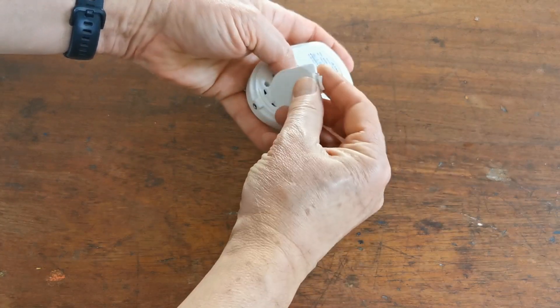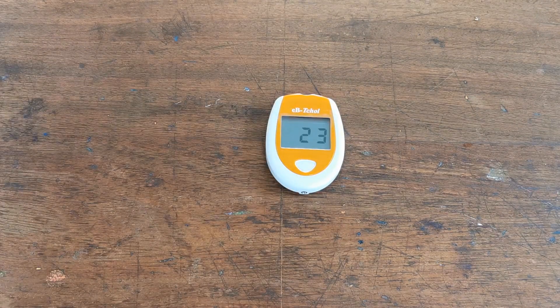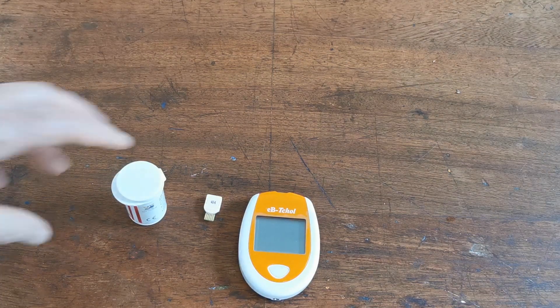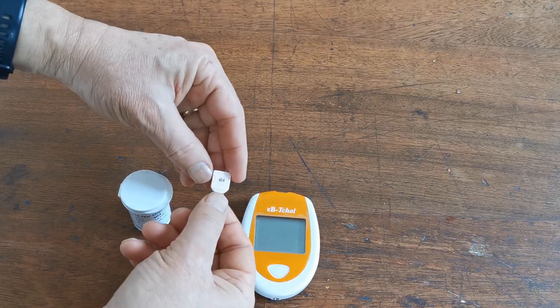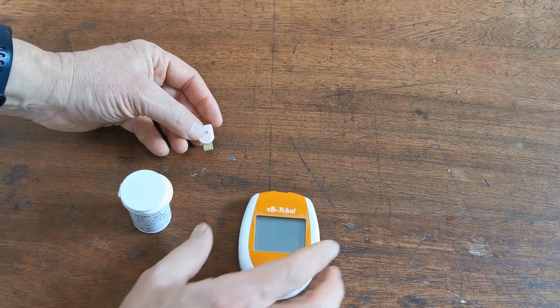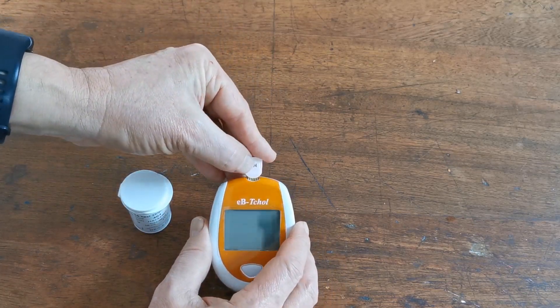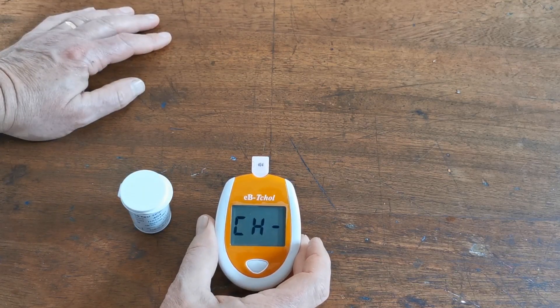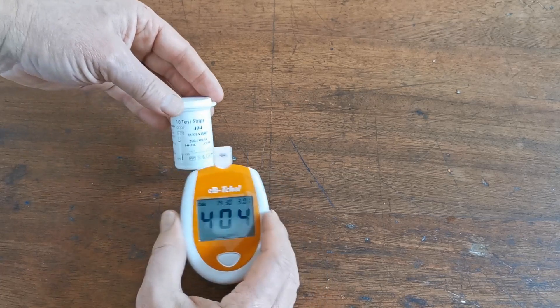That's all set up now, so I can put the battery compartment lid back on and we're ready to do our first test. One final element of setup before you start testing: each pot of test strips comes with a code chip — this one is 404 — and you need to calibrate the meter against those test strips. Take the code chip, insert it into the top of the meter, and it will beep: CH, code 404.